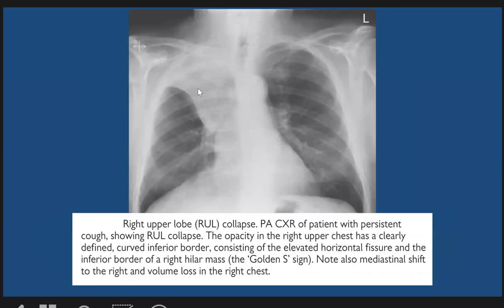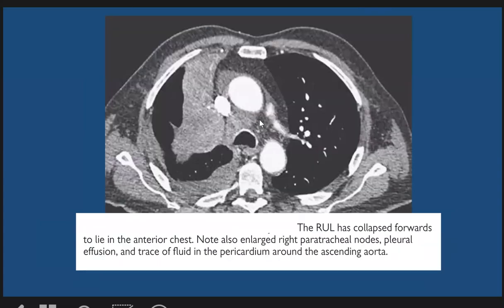Here is a patient with right upper lobe collapse with the Golden sign due to a mass lesion. You can see the minor fissure is elevated with this characteristic shape. On CT scan the same patient shows the mass lesion and the right upper lobe collapse, and the patient also has a right-sided pleural effusion.